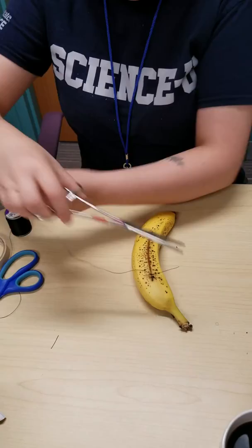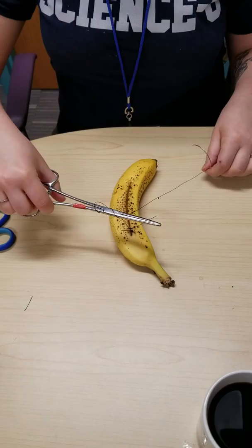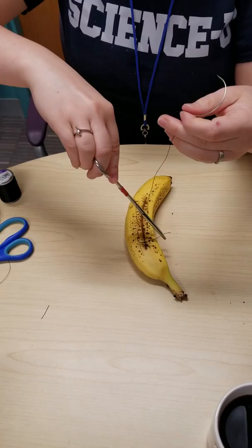Let's do another one on top. Two loops away from us, grab the end, pull off and tighten, and then one towards, grab the end, pull off, and pull tight. And then we're just going to cut our strings — they're small.